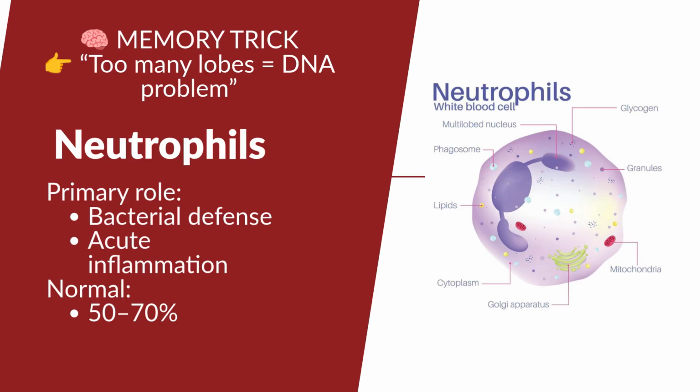And neutrophil morphology. A mature neutrophil is also called a segmented neutrophil, or seg. All right, I want to talk about some characteristics. Again, 2 to 5 lobes, pale pink cytoplasm, fine lilac granules, and clumped chromatin. One memory hack is segments are mature soldiers. Okay, segmented nucleus. The segmented nucleus is important because segmentation indicates maturity.